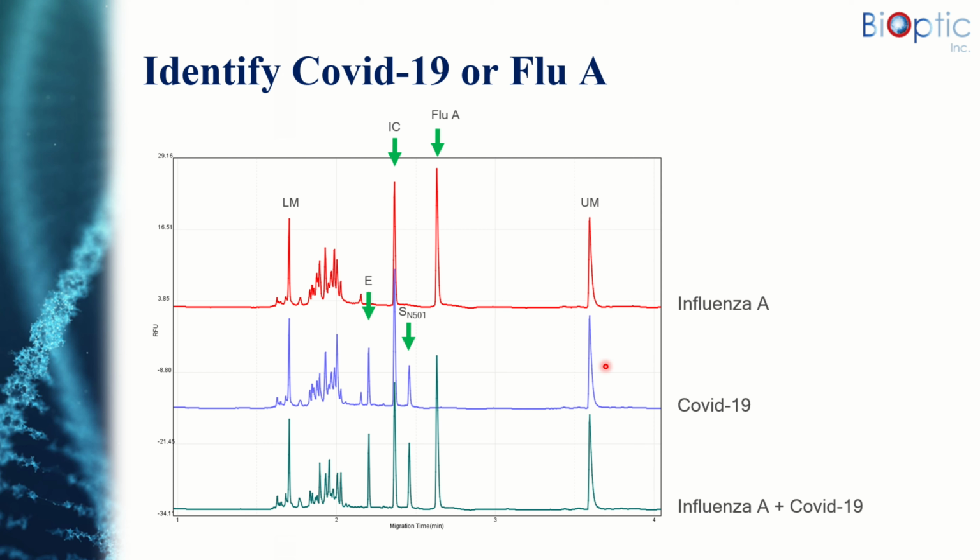In addition to the above COVID-19 mutant detection, we also have another branch line working on detecting COVID-19 and influenza A and B in one reaction. For now, we can distinguish COVID-19 and flu A. And next step, we will add flu B's primer to test it.